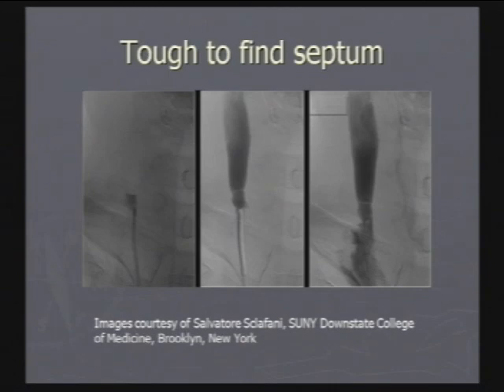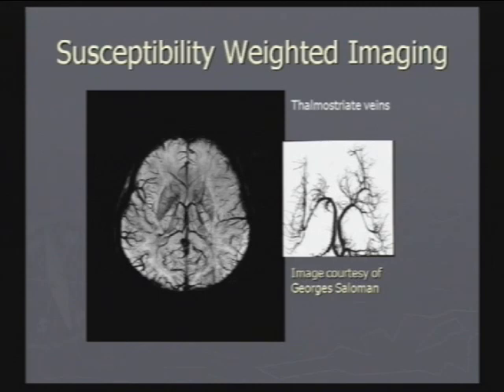So I'm going to move on a little bit now and talk just a bit about looking at the very small veins in the brain. And although I don't have these results here, I will tell you about Robert Savadinov's work. This is really a wonderful example where in 5 to 10 minutes, we can get a picture of all these small vessels in your brain, some of these as small as 200 to 300 microns.